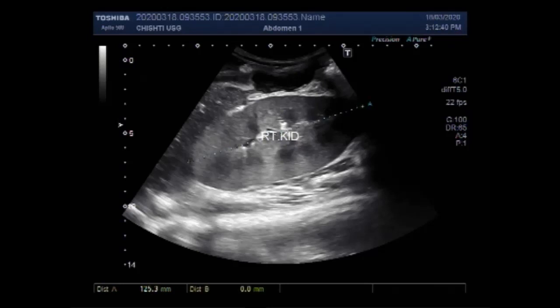The right kidney measures about 12.5 centimeters by 5.7 centimeters, with a cortical thickness of about 8.8 millimeters.